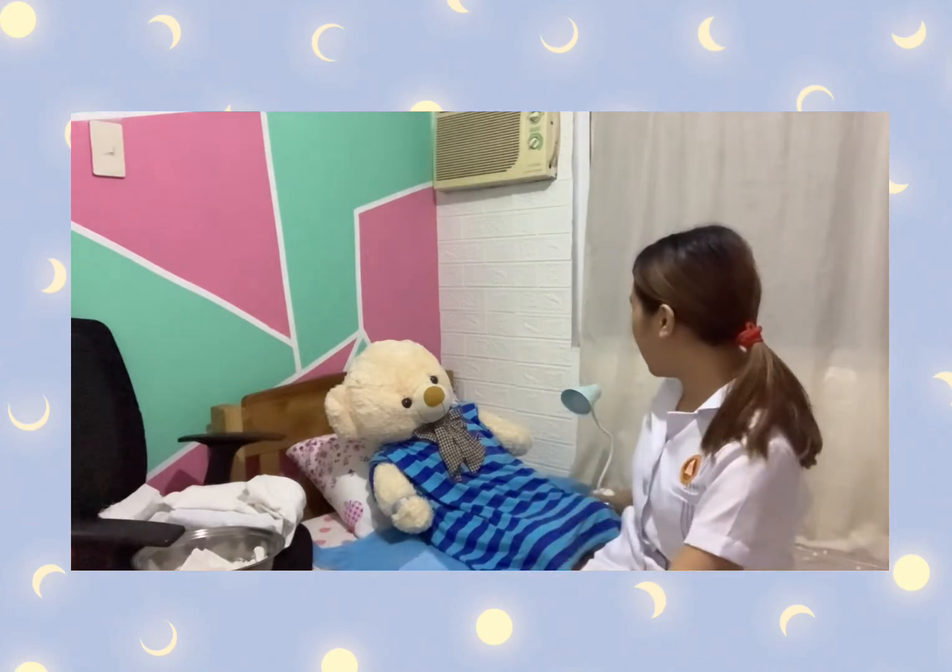Okay po. After that, you need to provide your patient's privacy by closing the doors and the curtains so that your client will be more comfortable and secured as you perform the procedure. And then, you also need to perform hand hygiene technique or any infection control technique to prevent the cross-contamination between the nurse and the patient. Also, we need to have an adequate lighting for better visualization when we are inserting the catheter.